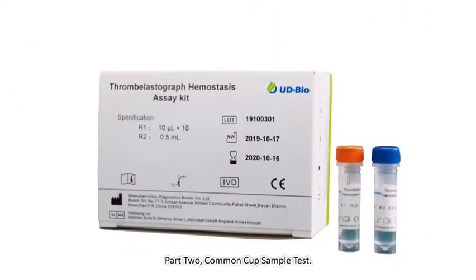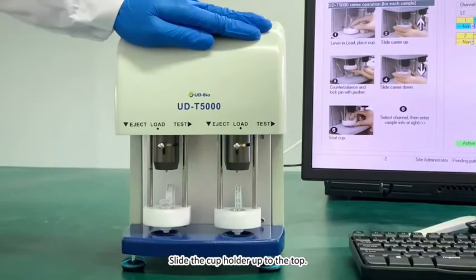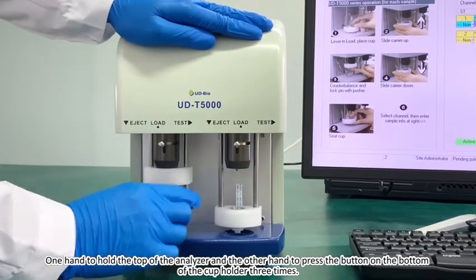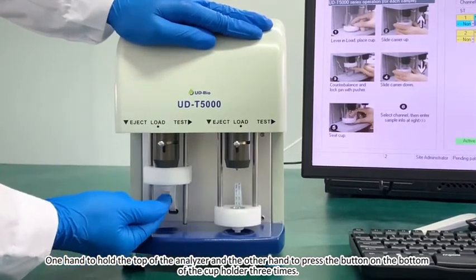Part 2: Common Cup Sample Test. Place the test cup in the cup trough smoothly. Slide the cup holder up to the top. With one hand holding the top of the analyzer and the other hand, press the button on the bottom of the cup holder three times.